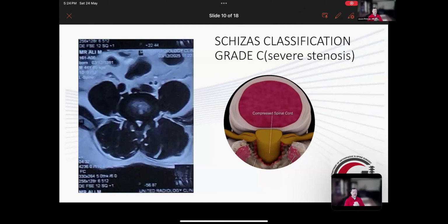Beyond that, 2 levels, I still tend to go down a tube because it takes me half as long as it would endoscopically. Don't forget the patient safety aspect, and time in the OR is safety. And be honest with yourself about where you are in your skill set and your application of this technique.